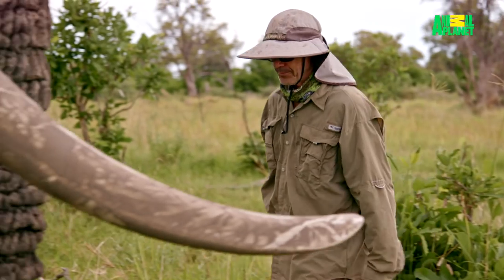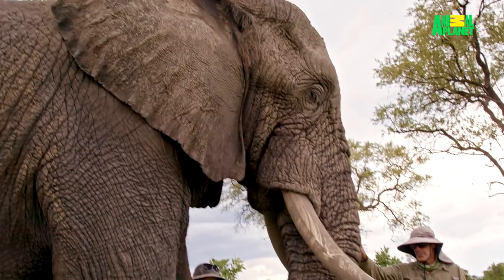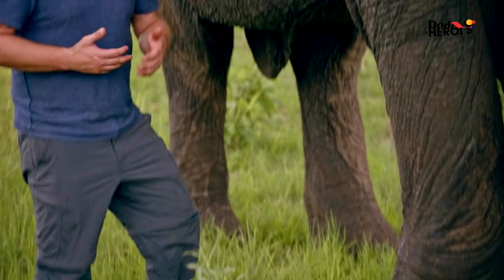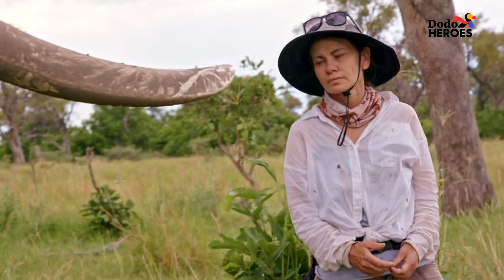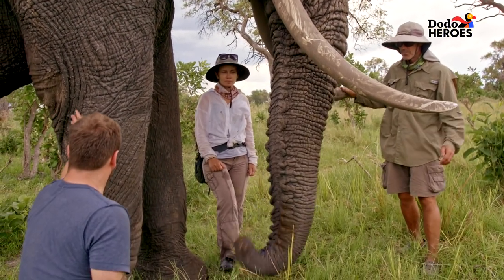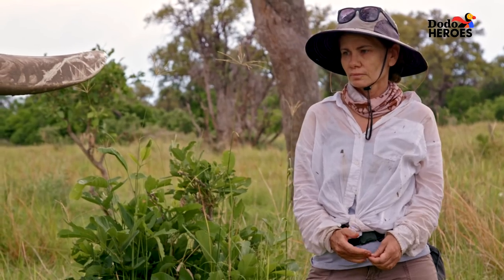Let me see that leg. A pretty severe angle inward, and that means he's experiencing a lot of pressure on the outside of his carpus. If you think of it like a human knee — people that have osteoarthritis, when their knees are in like this, that space is smaller, so you get a lot of meniscus wearing away, a lot of bone-on-bone. I'm only going to have a few days here in Botswana to adapt this brace, and hopefully I can get to a level where Jabu's wearing this and feels comfortable before I go home. The brace we're making is pushing inward and those forces will bring the leg into a more straight position.